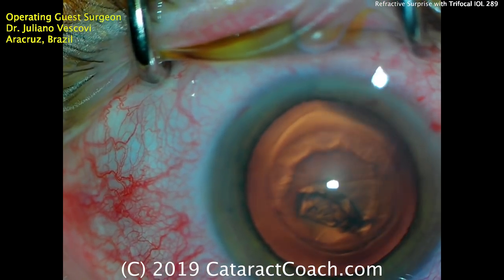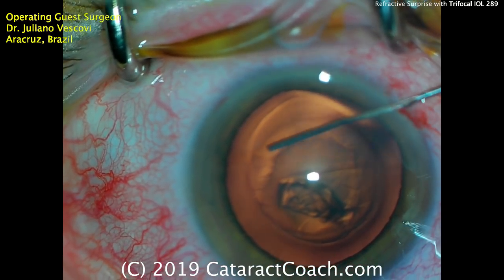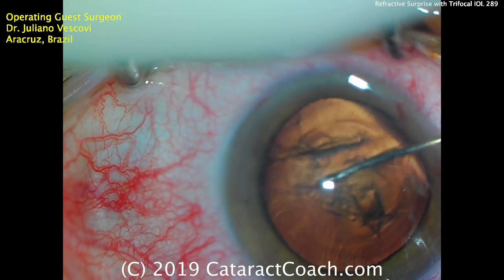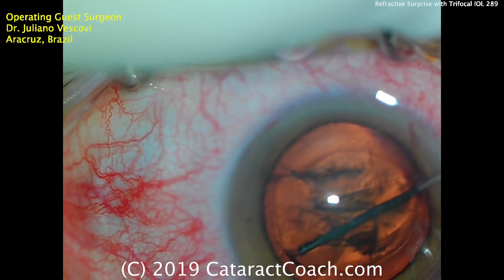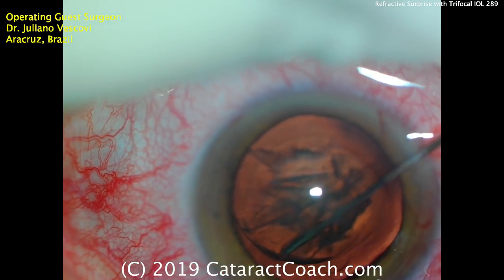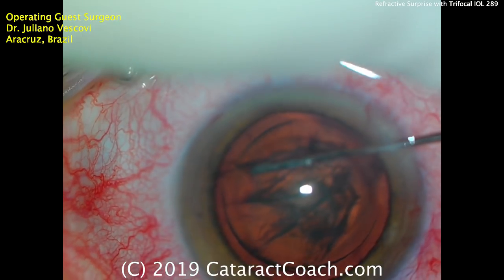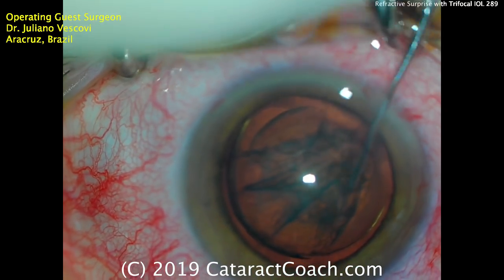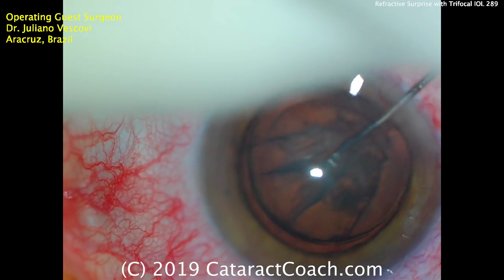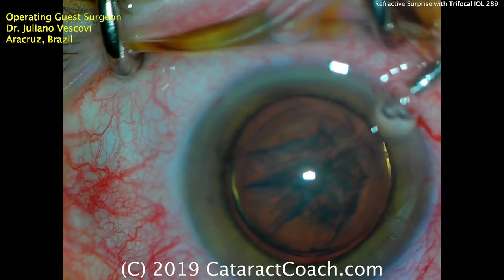A little balanced salt solution on the cornea — there's a very nice outline of the capsulorhexis. Balanced salt solution on a blunt cannula is used for hydrodissection. There's a good fluid wave, and another good fluid wave, and another — maybe a little bit of partial hydrodelineation there as well. This step of surgery is important; if you get a complete hydrodissection, it really does make nucleus removal a lot easier. That little golden ring is the hydrodelineation — that looks great.